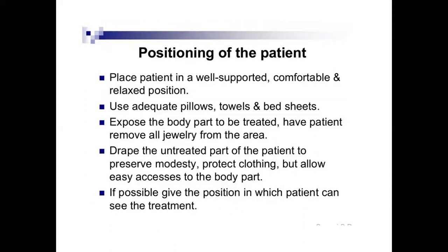Next up, we have the positioning of the patient. Place the patient in a well-supported, comfortable, and relaxed position. Use adequate pillows, towel, and bed sheet. We expose the body part to be treated. Have the patient remove all jewelry from the area. We drape the untreated part of the patient to preserve modesty and protect clothing, but allow easy access to the body part. If possible, give a position in which the patient can see the treatment.